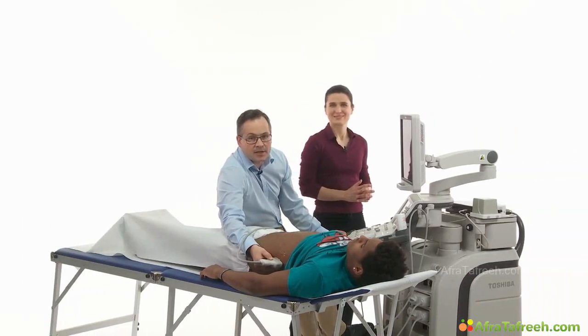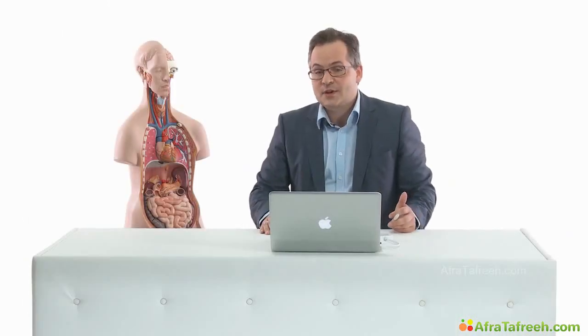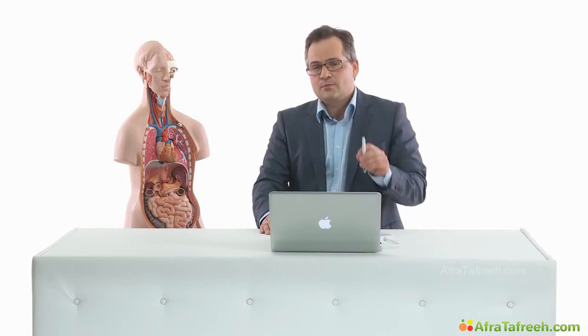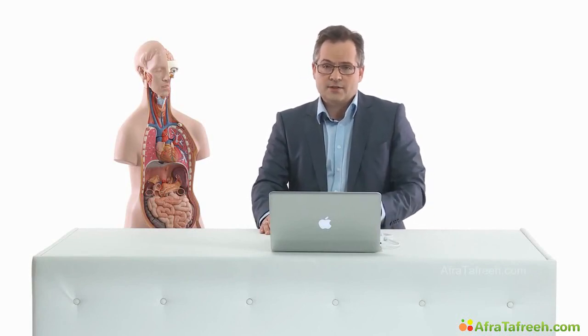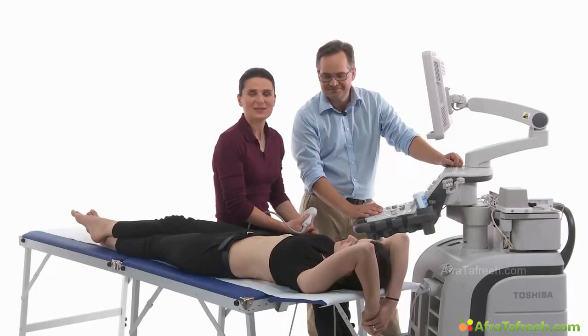So these two planes are used to make a full examination of the pancreas. Now we have seen different ways to find the pancreas. But the most important information is: search for the splenic vein and you will find the pancreas. This is the main landmark you have to look for. Now let's go for the pancreas.